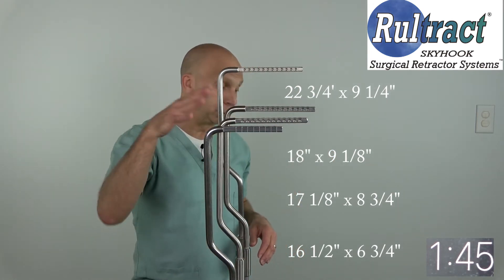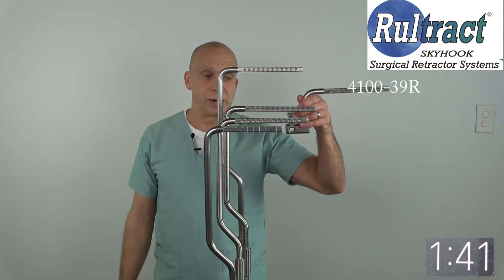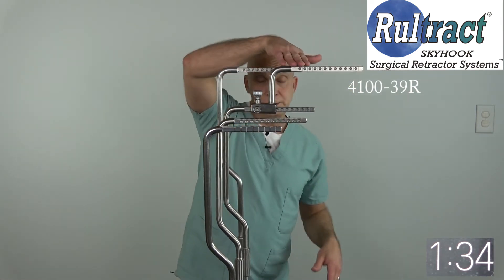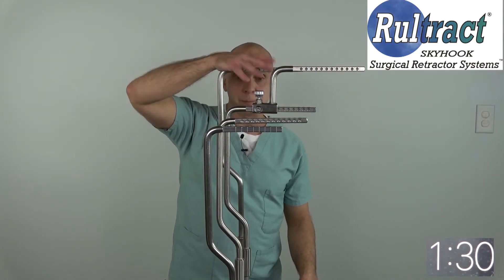The other option is the extender bar — the riser extender bar. You can see if I put this on even our standard length newest generation top post, it brings it up to the height of the extended length top post.